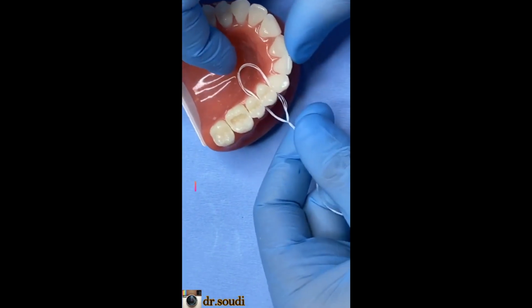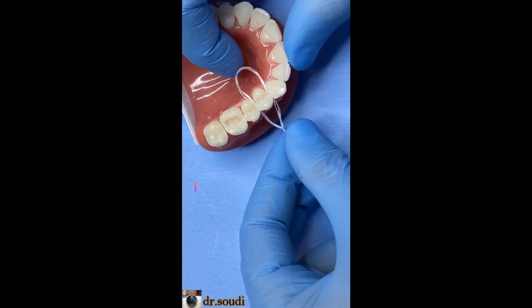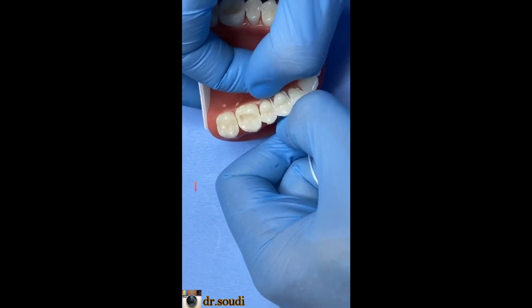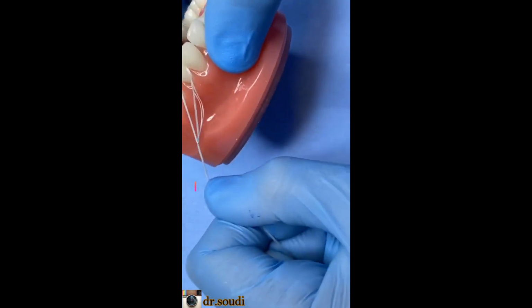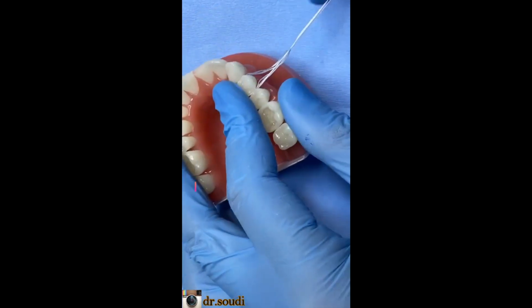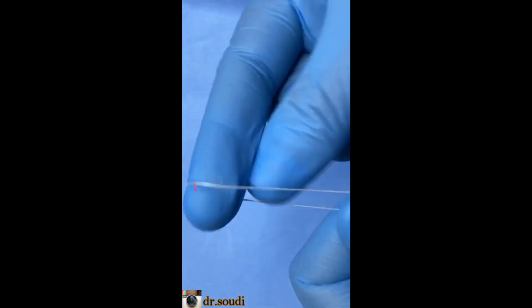After you pass it, don't take it like this straight. Adjust it to the tooth first, like this. Press it like this, and from downward, you can move it. The contact is great, very great contact, really. We will make another one.